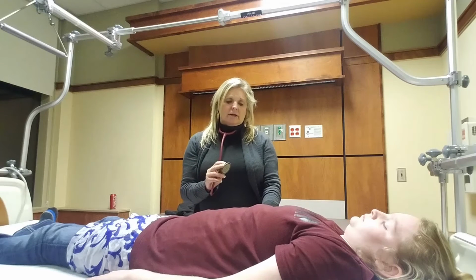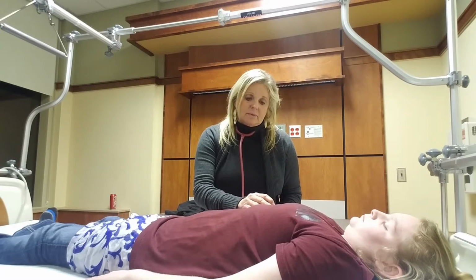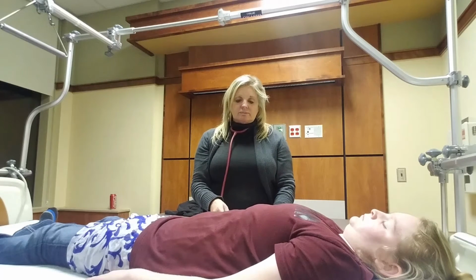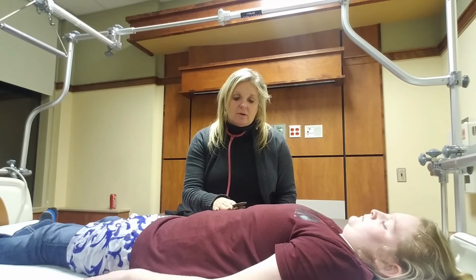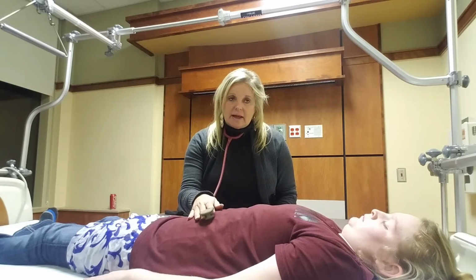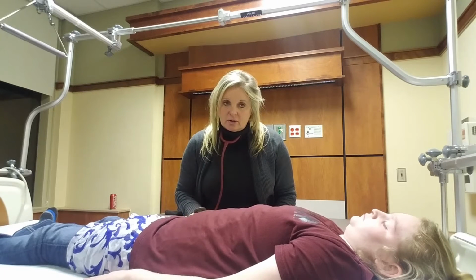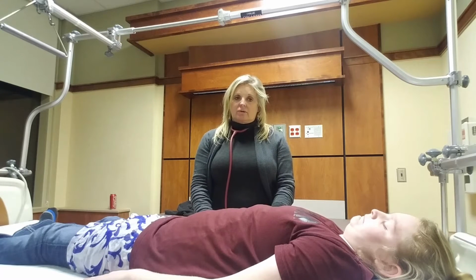Okay, and while we're auscultating, we're going to have her take a deep breath while we're listening to the liver area, and over the spleen area. What we're listening for here is any friction rubs, and I didn't hear any friction rubs. Then we're going to take the bell of the stethoscope and put it over the aorta area, and we're going to listen to the aortic artery. Then we're going to listen bilaterally to the renal arteries, then bilaterally to the iliac arteries, and then bilaterally to the femoral arteries. What we're listening for here is any bruits, and we didn't hear any bruits, so that would be a normal finding.